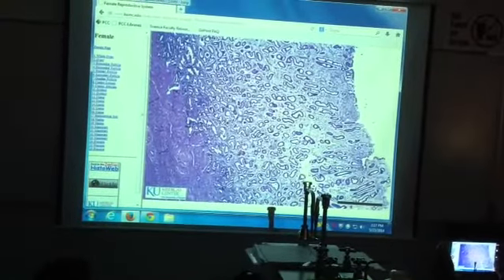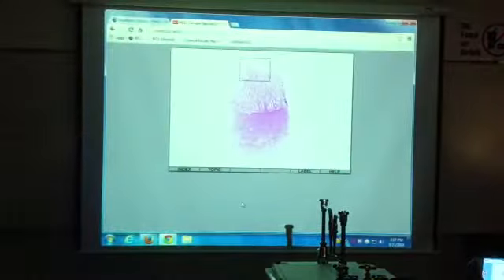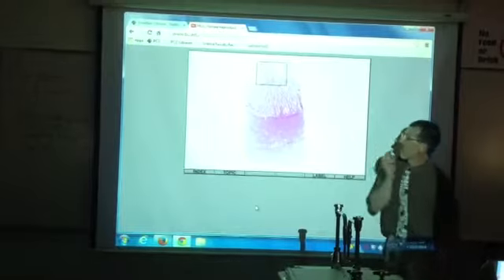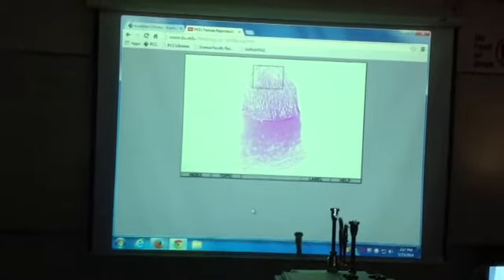Okay. So then, let me show you this picture here. This is from far away, but you can see the uterine glands up there. So what phase do you think that is? That they're straight and long. Proliferative, you're growing. So proliferative phase, straight and long. Okay, smarties.